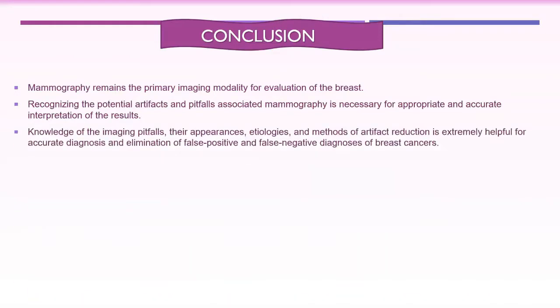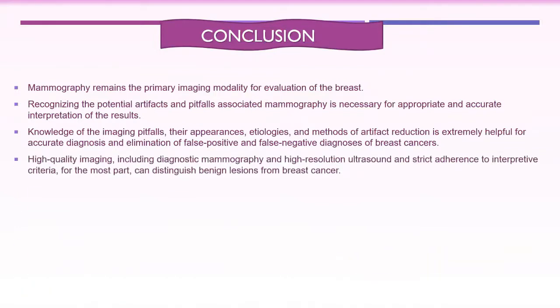Knowledge of the imaging pitfalls, their appearance, etiologies, and methods of artifact reduction is extremely helpful for accurate diagnosis and elimination of both false positive and false negative diagnoses of breast cancers.